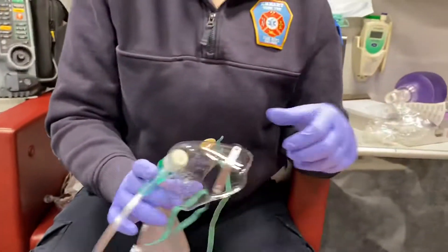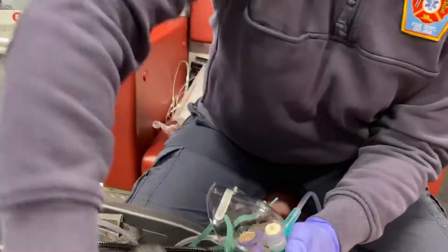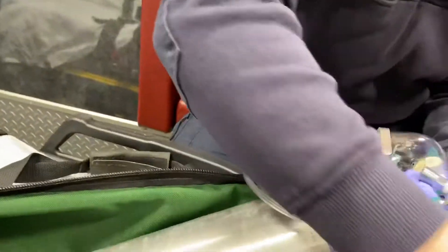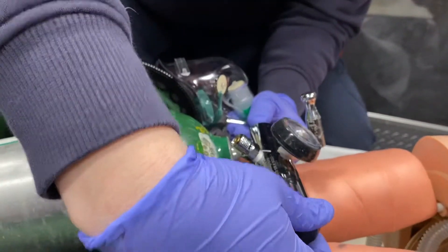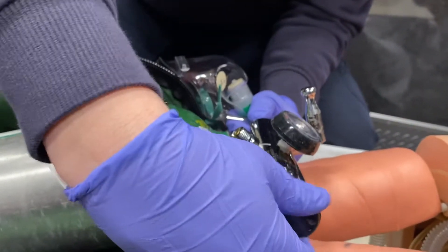You're going to connect your oxygen tubing to the oxygen tank. You want to make sure your tank is on, and then you're going to set your flow meter to 15 liters per minute.